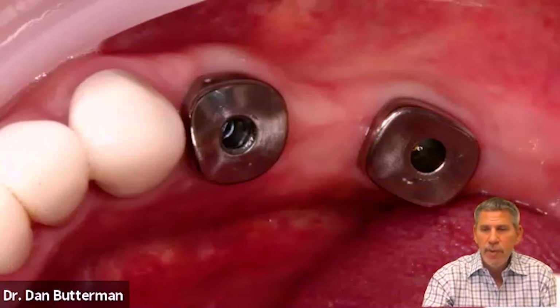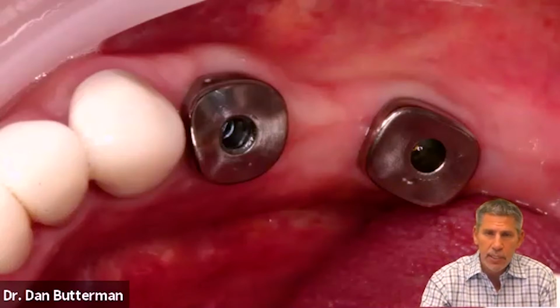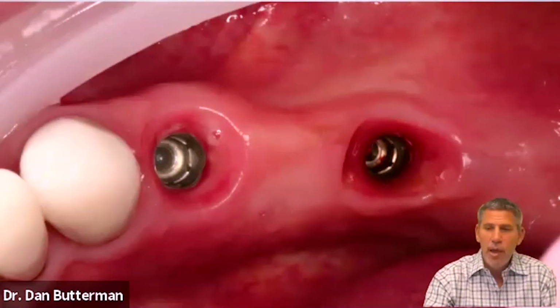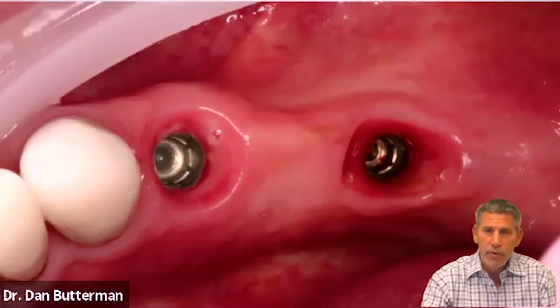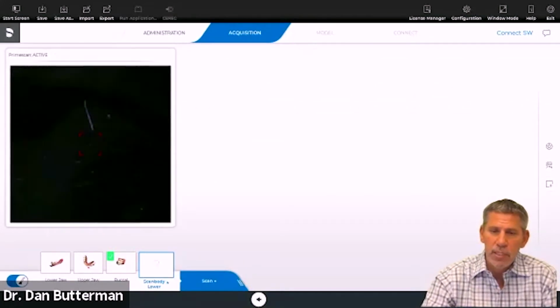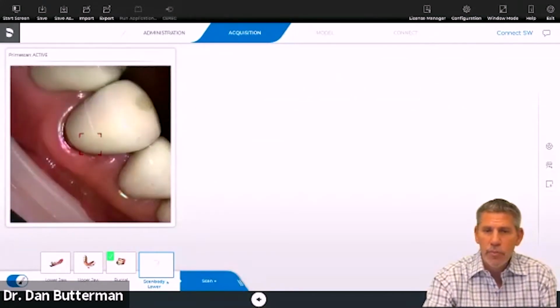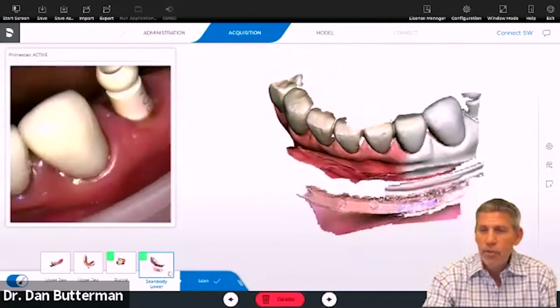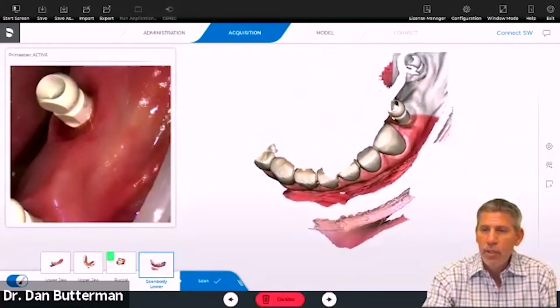But once this patient comes back, we now have tissue that's healed up nicely and is healed up to the shape that the final abutments are going to be. So now I can remove those temporary healing abutments, and we can re-image. So the patient comes in for imaging, and if we're doing a bridge, it's basically the same idea. I'm just going to place those IOflow scan bodies on top of there, and we're just going to capture all of this.